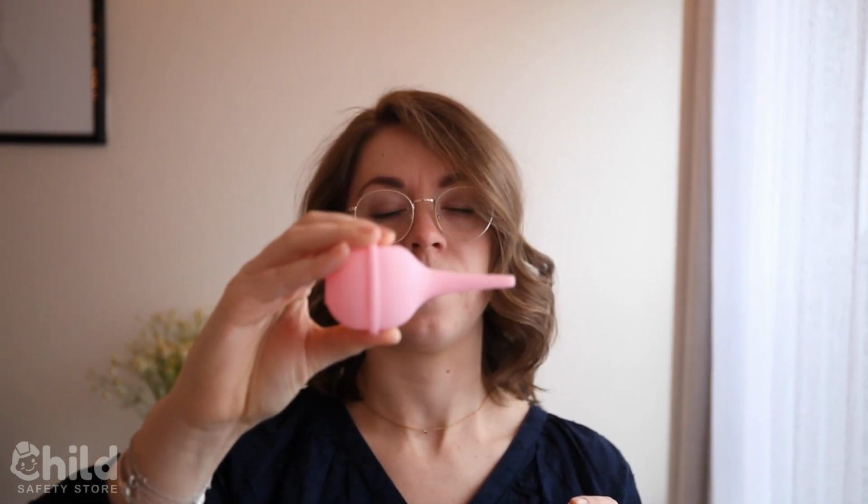You can control how much force you pull with by how quickly you open the aspirator. It's not too powerful, it shouldn't harm them, but you can go a little slower if you don't want to just release altogether, if you want to be careful about how much pressure you're putting on. When you release the bulb, it should get mucus out of their nostril directly and make it easier to breathe.